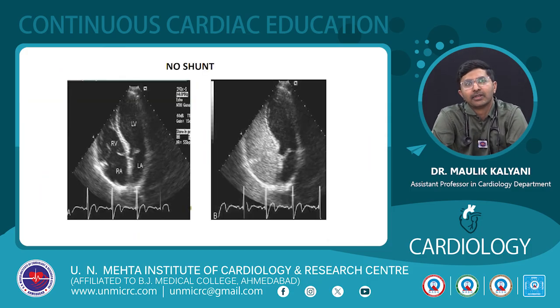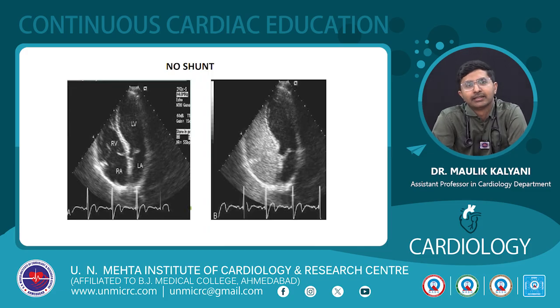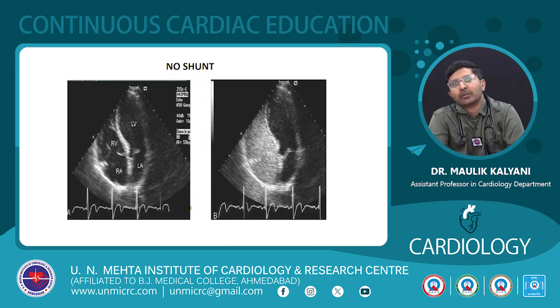So this is the normal contrast study. There is no shunt, so the contrast from the venous injection opacifies the right atrium, then subsequently the right ventricle and pulmonary artery, but it will not opacify the left atrium or left ventricle. There is an echo dropout at the superior portion, which might look like an ASD if not seen carefully, but this contrast echo is essentially normal. That suggests that there is no shunt.